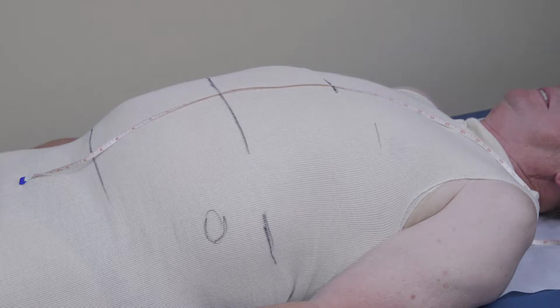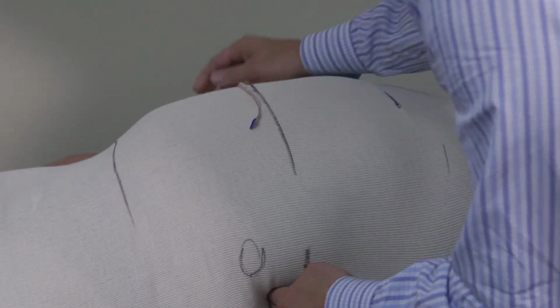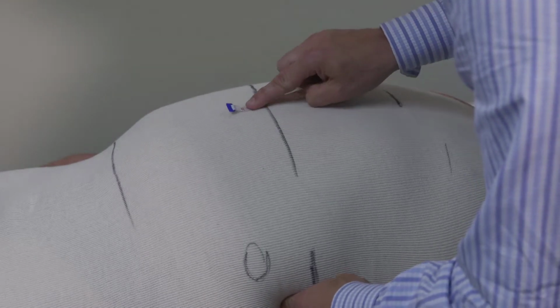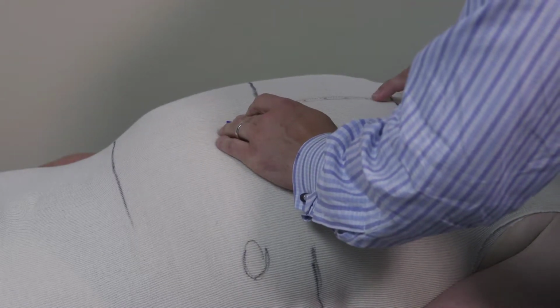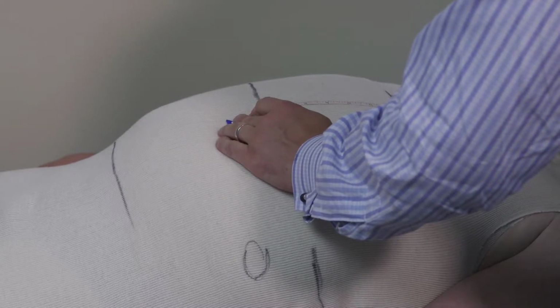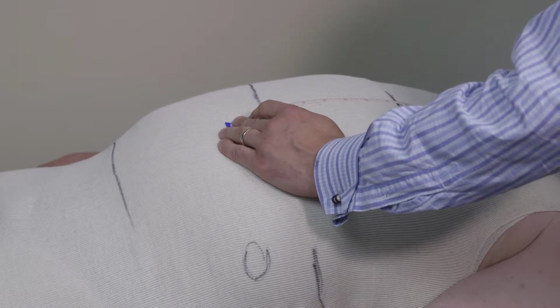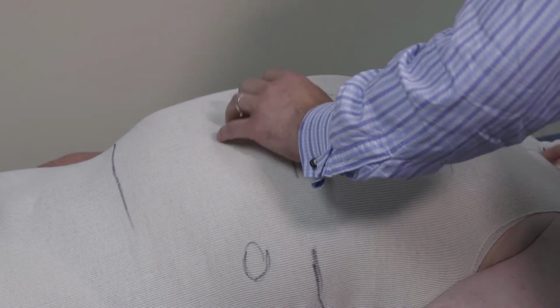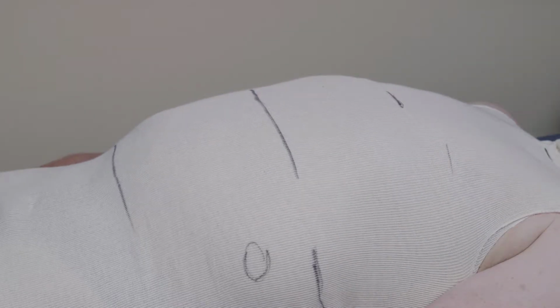And we'll take our other shorter measurements here. So we'll go now from the waist. I'm going to find his waist here. Waist to xiphoid is 6 again, so that's the same. And waist to sternal notch is 16.5. Now let's take our 3 charts that we just created and compare them side by side.